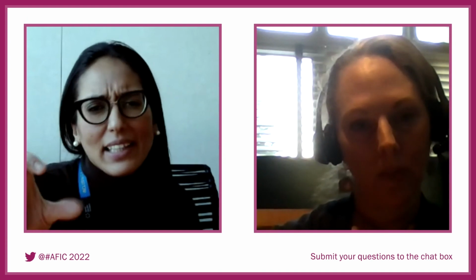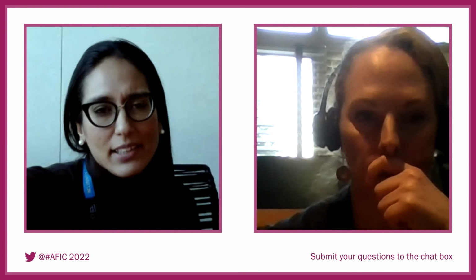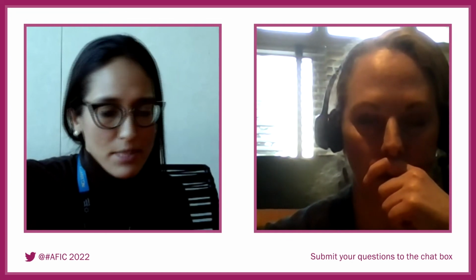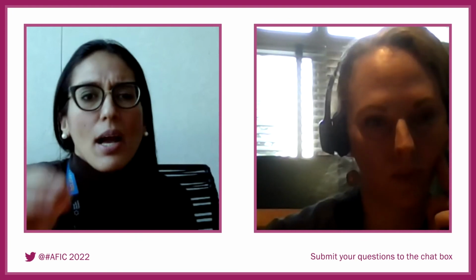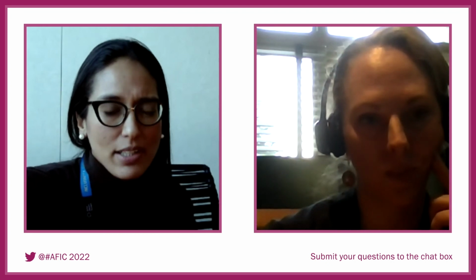But I do find that technically it's often a little difficult, when they're really early on, to get a really good measurement of the lung. So there are probably some technicalities with it. When you typically make the diagnosis, they are around the anatomy survey. When you're going to prognosticate and provide counseling, you'll do it at that anatomical survey time. We'll counsel them based on that number, but we really go by our numbers at 26 to 28 weeks, because that's where we offer fetal intervention. Usually it's similar, but that's the timing of intervention to classify the severity as well. It usually doesn't change much, but in terms of fetal intervention, that's a key period of time.